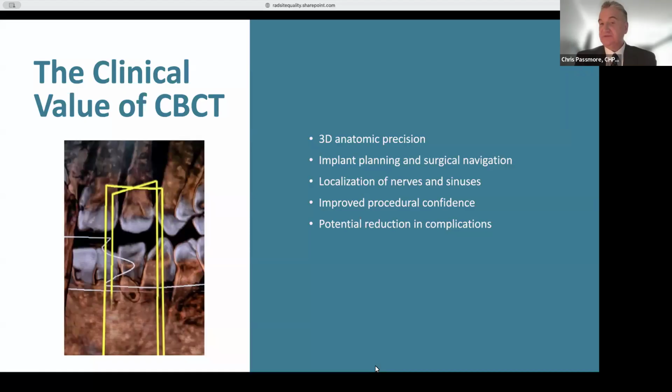Yeah, by looking at dosimetry results, we can tell which dental offices are using cone beam CT or traditional X-rays. We see a surge in, say, the dental implant arena. Also, we're seeing some uptake, I would say, of implementation in special needs dentistry or even in pediatric dentistry.